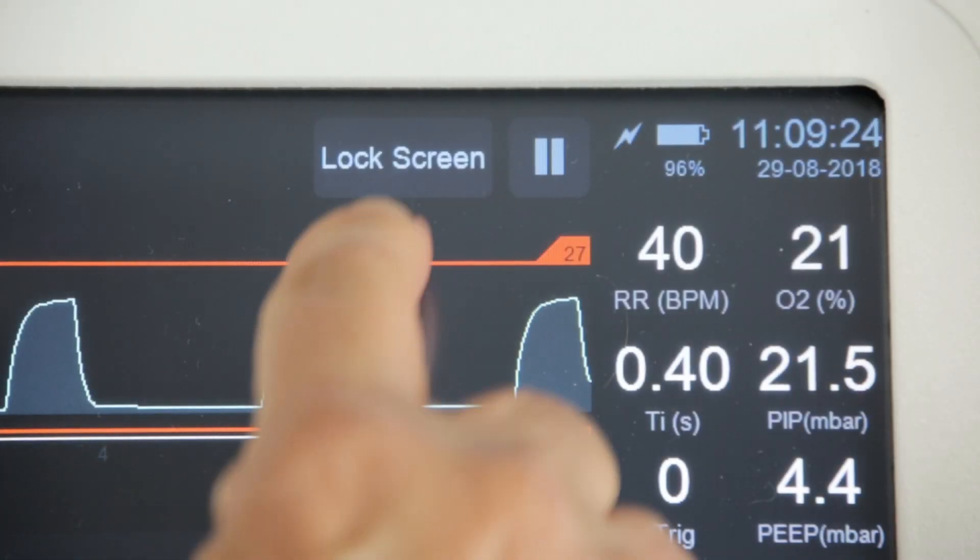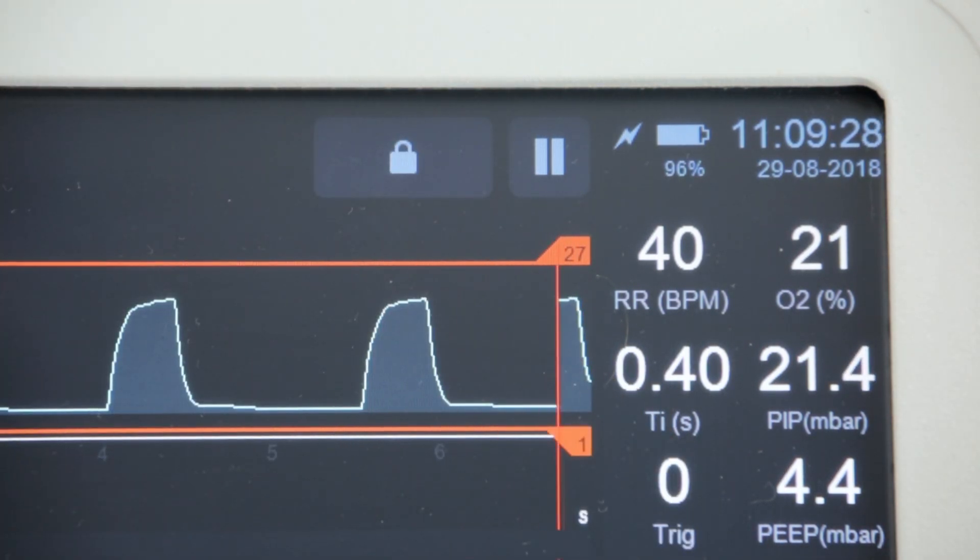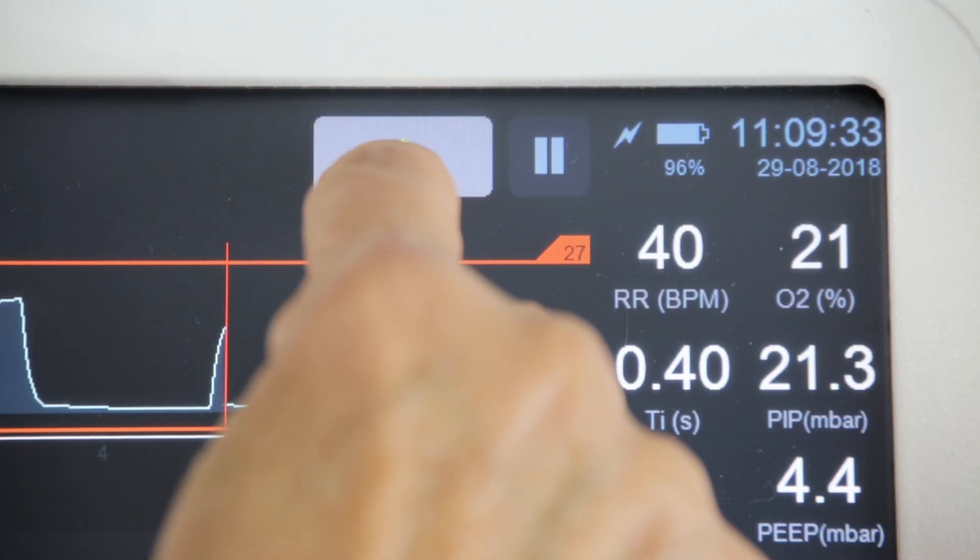Lock screen button: Pressing this button locks the screen. To unlock, press it and hold for one second. In the event of an alarm, the screen will automatically unlock.